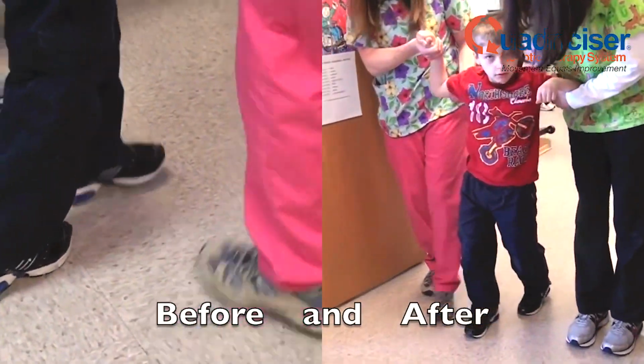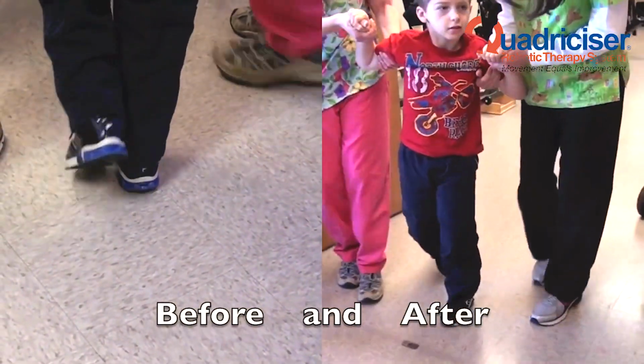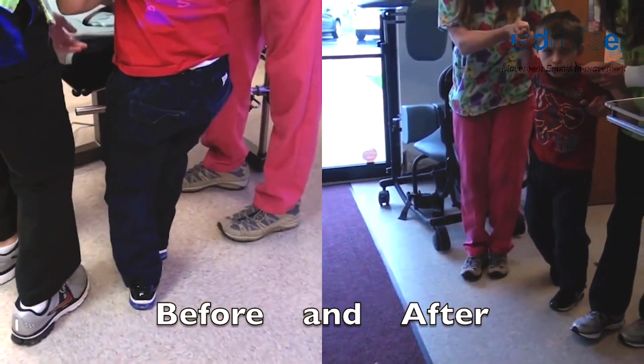I think overall, when the speech therapist comes in, because a lot of times when the students are in the quad, they become more verbal. That's the time because they're happy, they choose to talk. So the speech therapist will come in and position herself next to the student who's in the quad, and she will do her therapy session there. And she gets way more than any other time out of the student. So it helps them become more verbal.